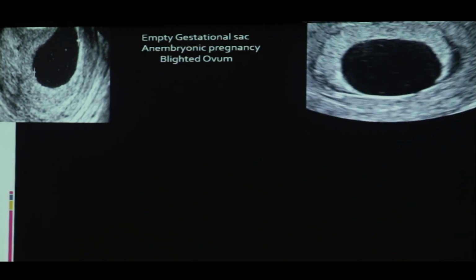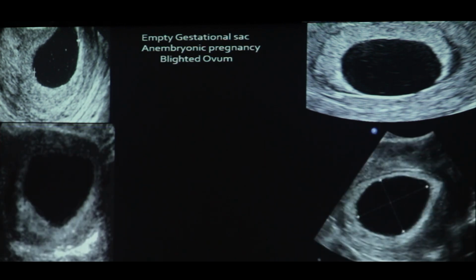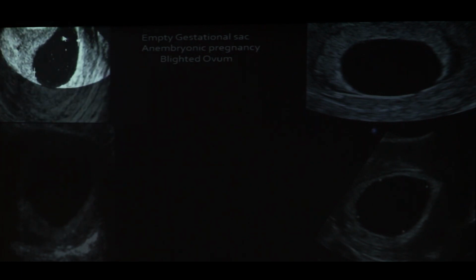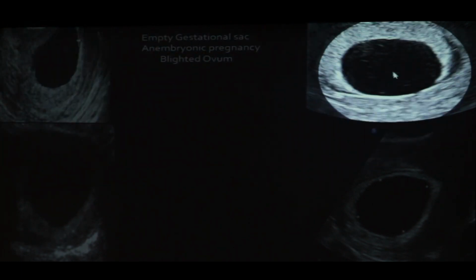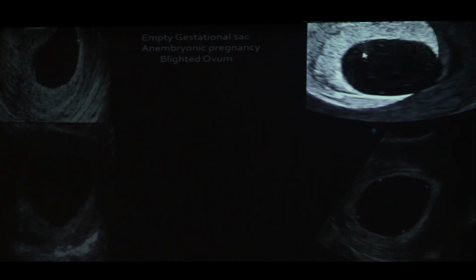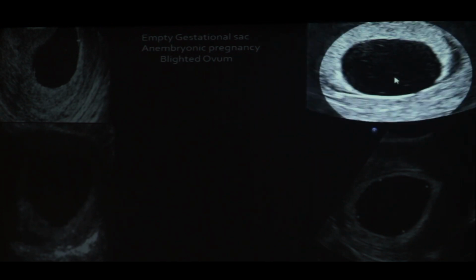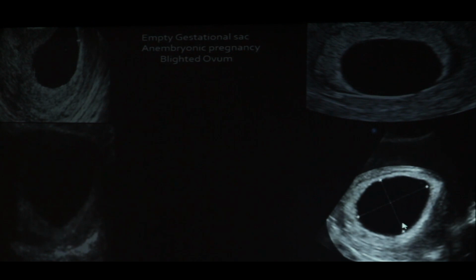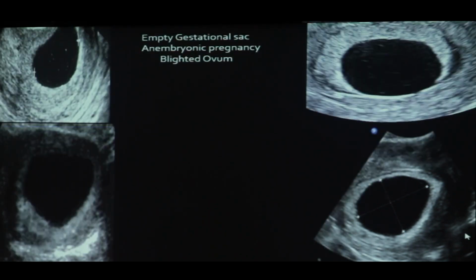So here, what I am seeing is a gestational sac. Now see, I don't see any fetal pole over here, and here there are some echoes in it, and on the top I am seeing no fetal pole. And if I take measurements, I will demonstrate that I am dealing with a gestational sac of more than 20 millimeters with no fetal pole.